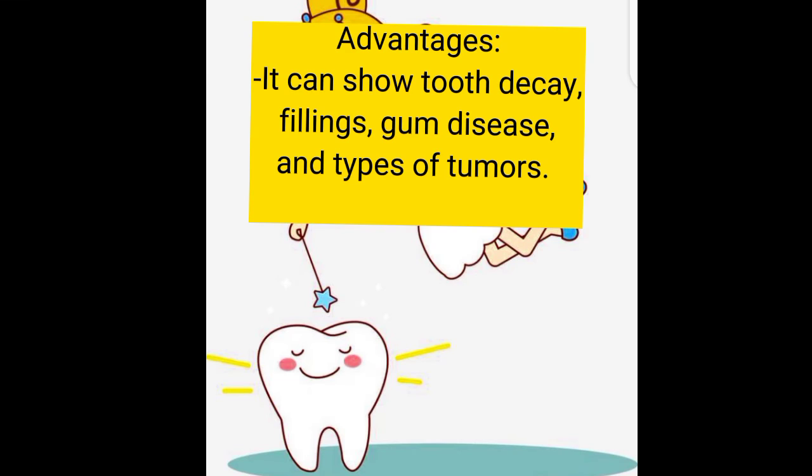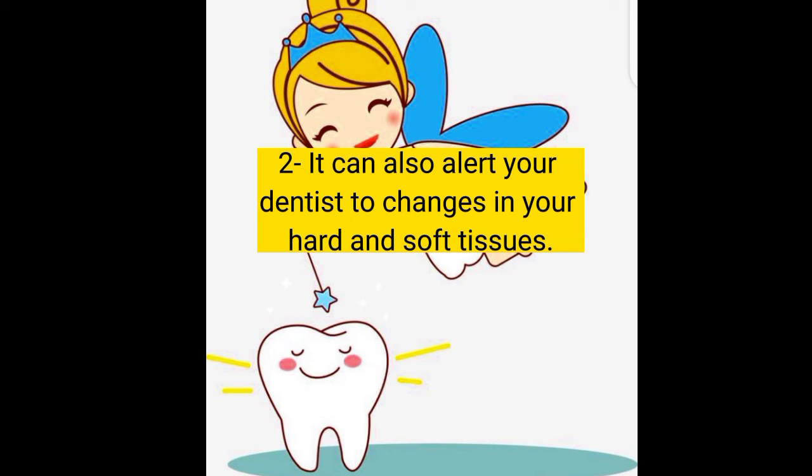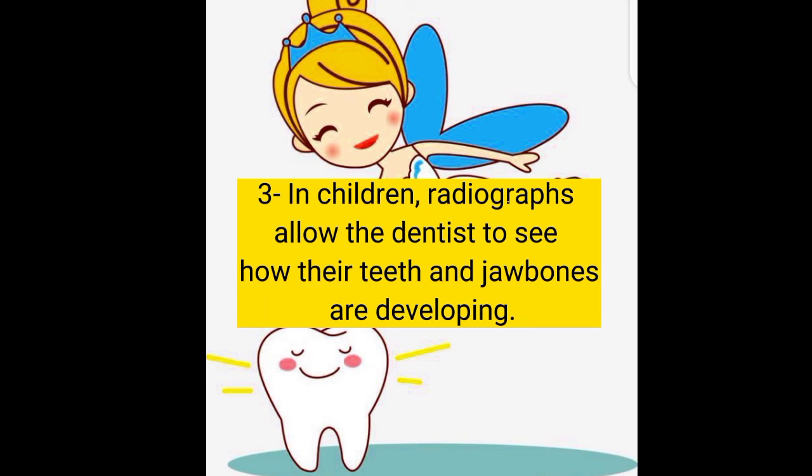Advantages of radiographic technique. It can show tooth decay, fillings, gum disease, and types of tumors present in the oral cavity or the bony or hard and soft tissue. It can also alert an operator to note the changes in hard and soft tissues. In children, radiographs allow the dentist to see how their teeth and jaw bones are developing. So the operator can predict any malformity in the jaw bones or teeth that will happen in the future.